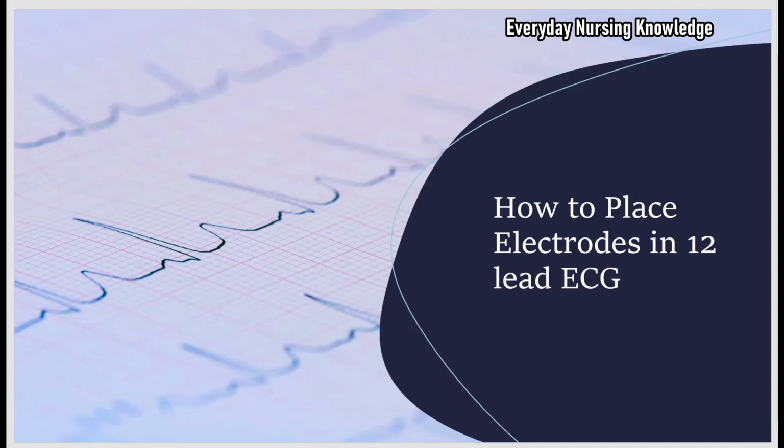Welcome to Everyday Nursing Knowledge Lectures, and today we will learn how to place electrodes to get a 12-lead ECG.